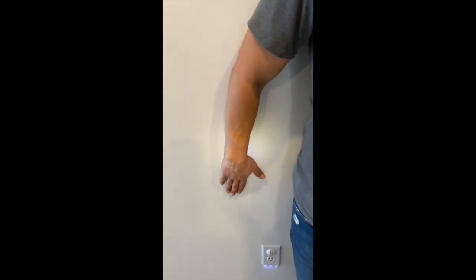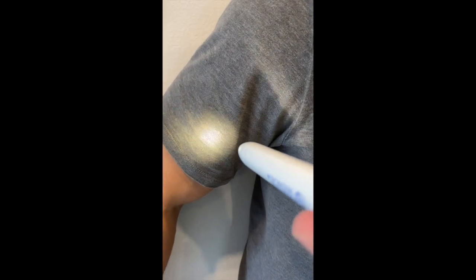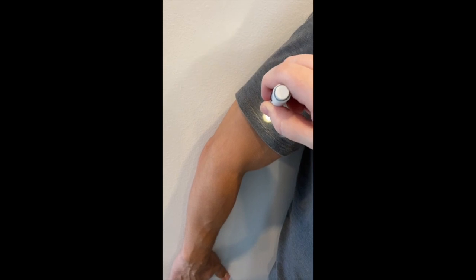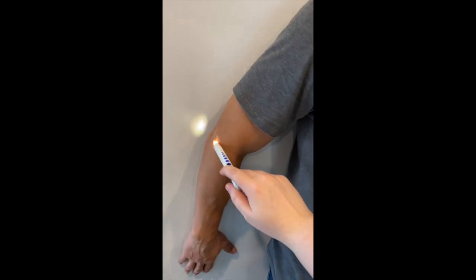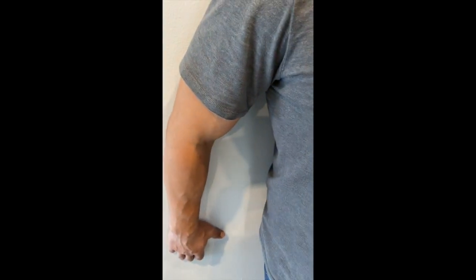The central ray is going to be perpendicular to the mid-humerus. Just remember, you also want to include the elbow joint, but you also want to include the shoulder joint as well. You also want to make sure that the patient is slightly flexing the elbow, but not completely.